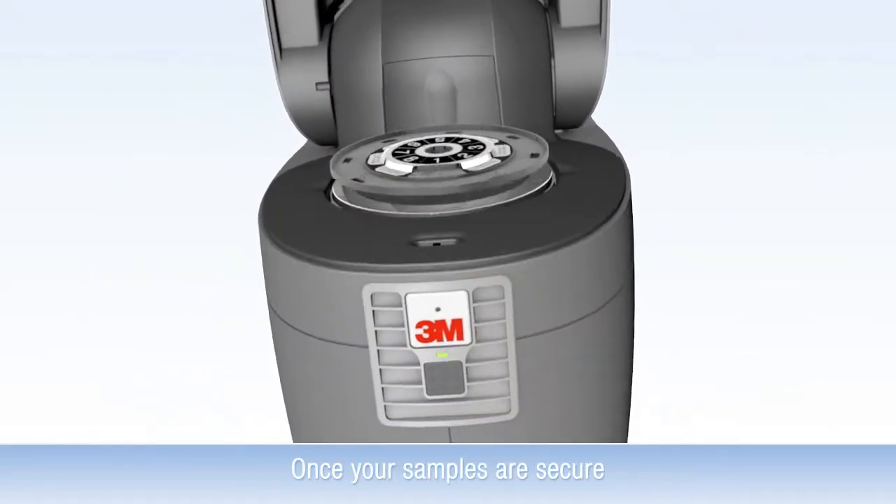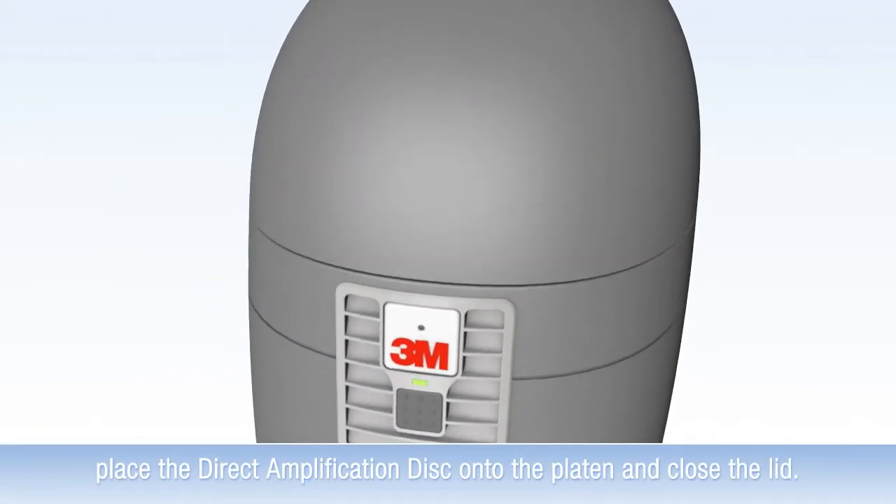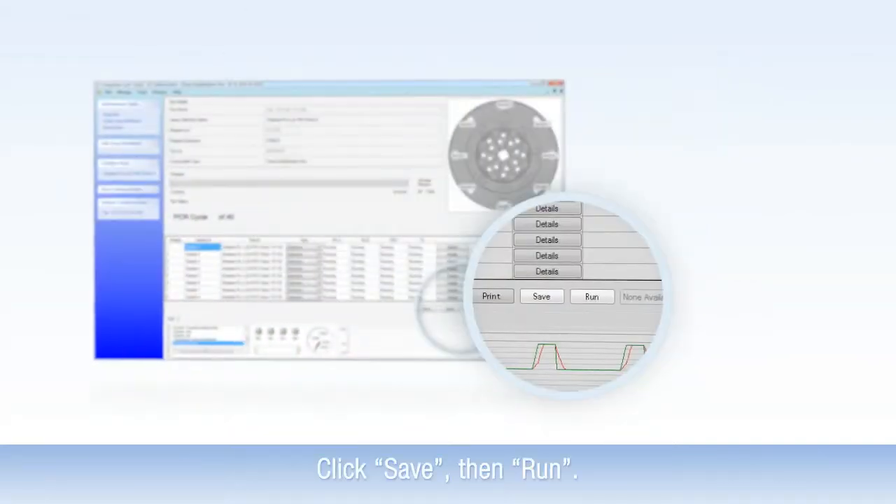Once your samples are secure, place the direct amplification disk onto the platen and close the lid. Click Run.